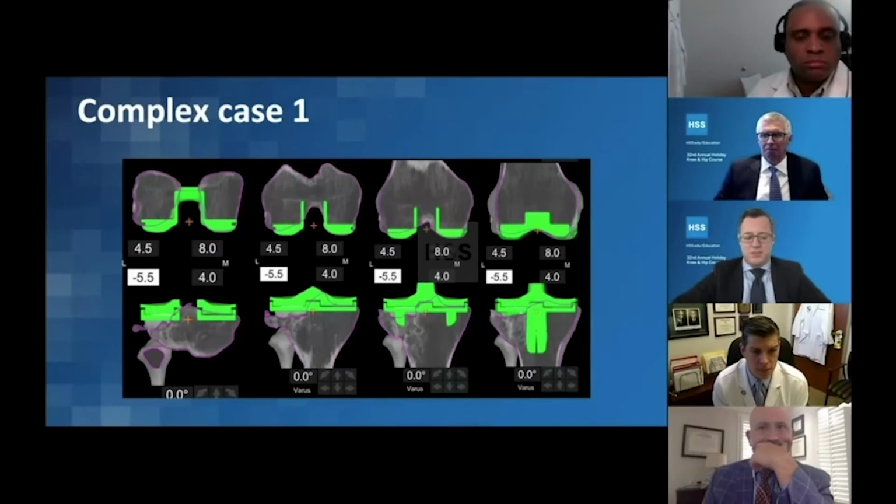Anything concerning here, Brian? Or is this just a straightforward, cement, maybe some screws and cement? Yeah, so I think it depends on the location of the defect.